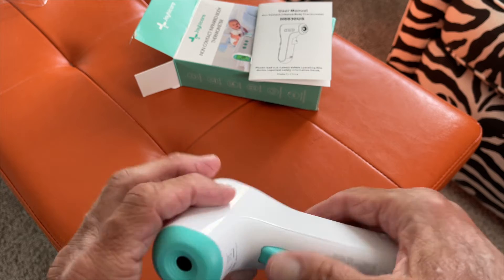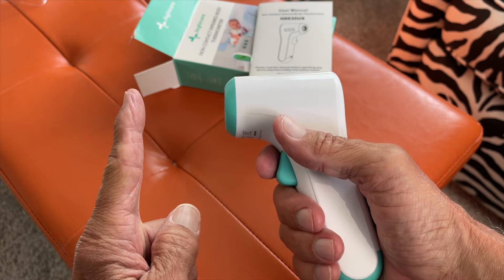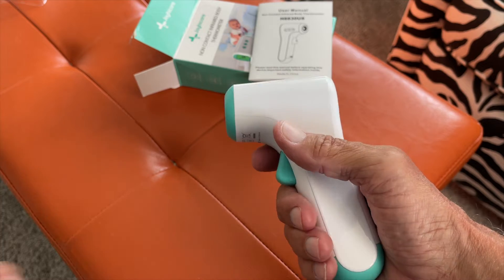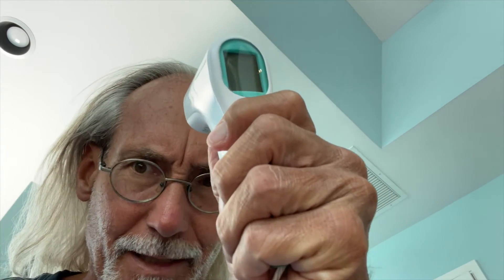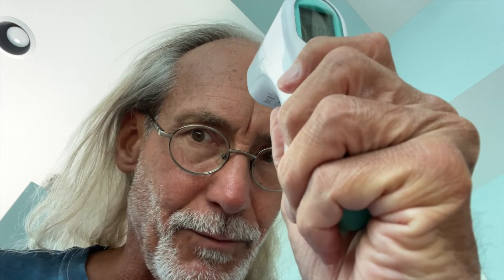You press that trigger on it, point it about this far away from your forehead — right in the middle here — and I am at 98 degrees. I think you're supposed to be 98.6, right?